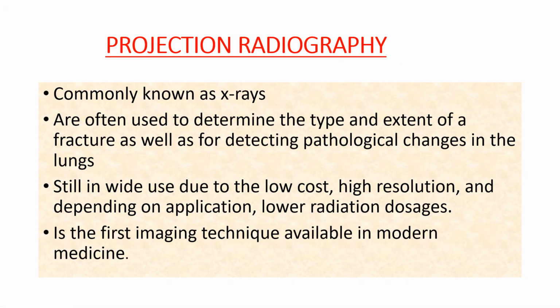What is projection radiography? This is the type of modality that everybody knows, that is commonly called X-ray. They are used to determine the type and extent of fractures, as well as detecting pathological changes in the lungs and other parts of the body, and are still in wide use due to their low cost, high resolution, and, depending on the application, lower radiation doses. Projection radiography is the first imaging technique available in modern medicine.